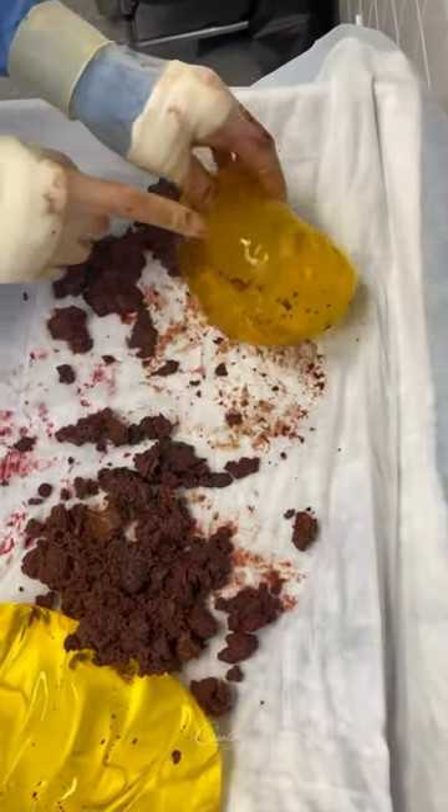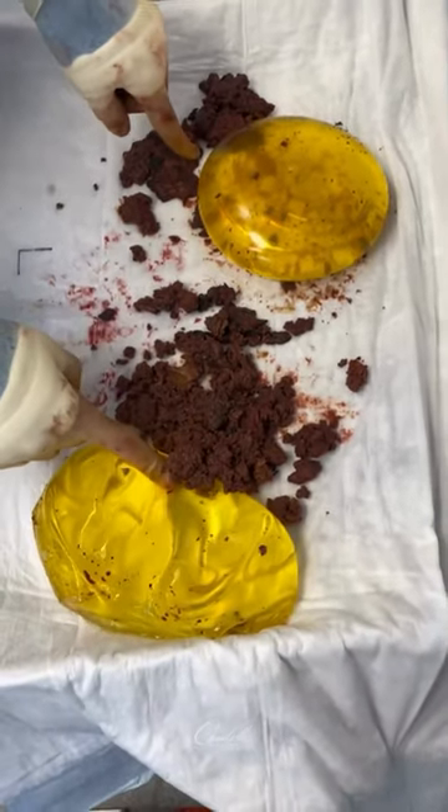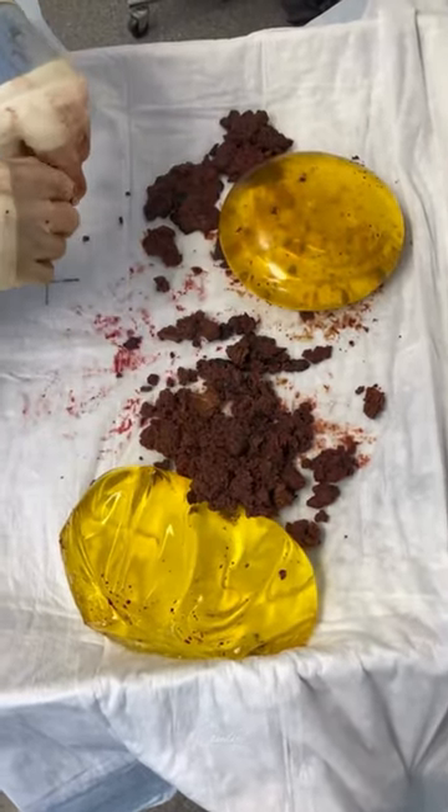So when you're doing a case like this — and see, this side is not ruptured — what you're thinking is how we prevent bleeding in the capsule this time around, so we can prevent this terrible thing from ever happening again.